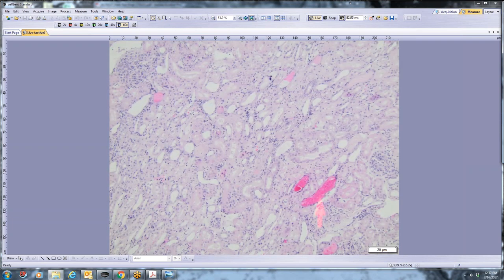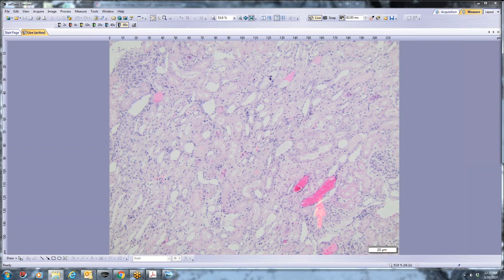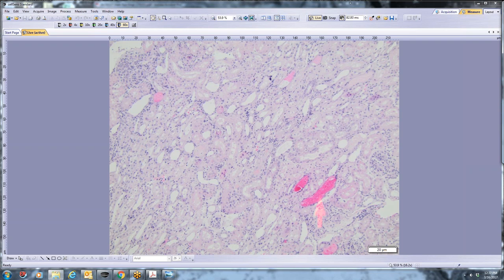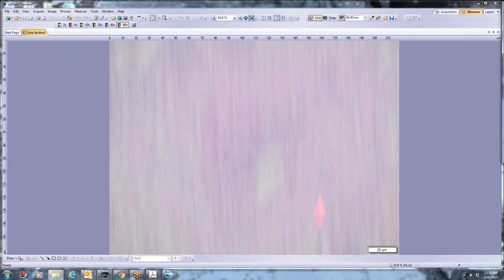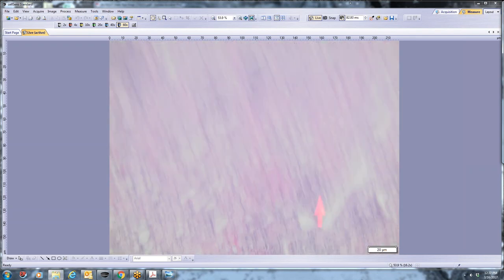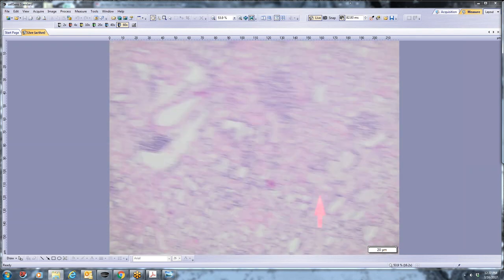So like these right here are red cell casts, so we know we have some degree of glomerular hematuria. That's the only way that you can have those types of red cell casts. Some of the glomeruli, at least, are rupturing and releasing red cells into the tubules. So that's already a trigger there.